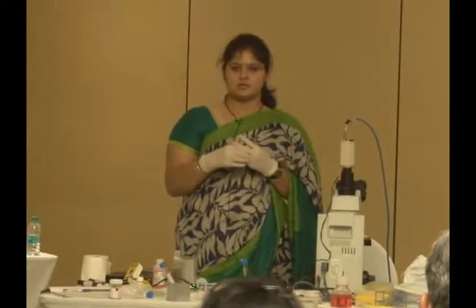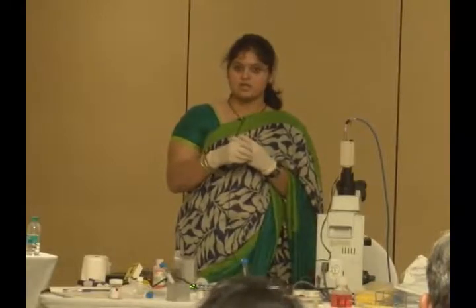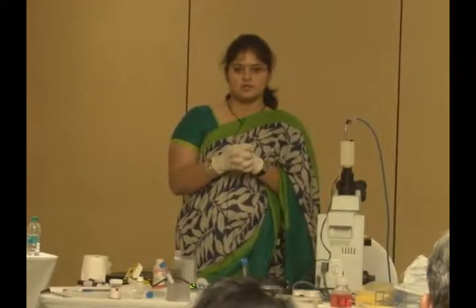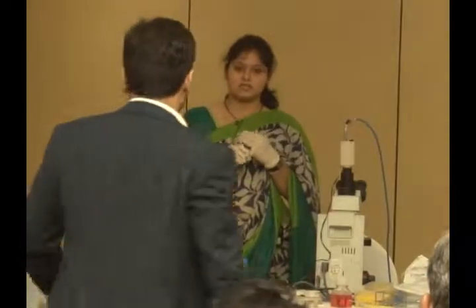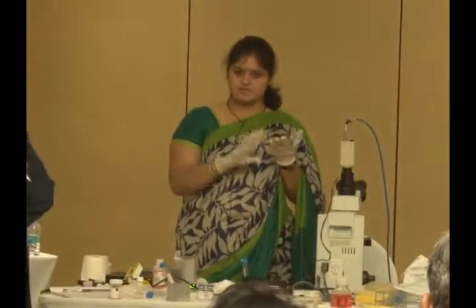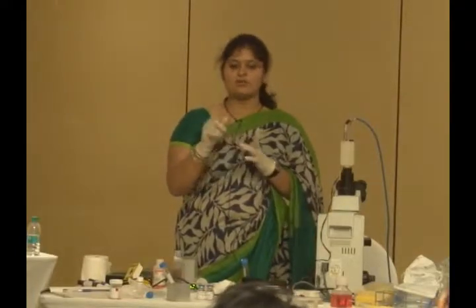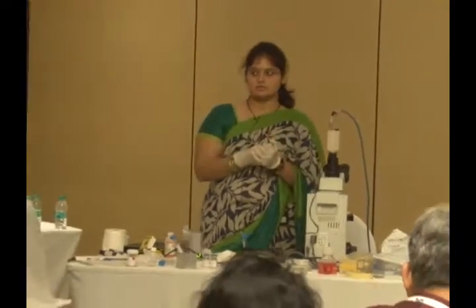While handing over the patient with the sample, do we need some information about the sample? Yes, ask him to keep it in the pocket so it is near body temperature. You can give the count. What is the count in the sample? What process you have done, whether swim up or density gradient. Pre-count, post-count, and motility also. Count and motility you have to give, so the doctor also knows.